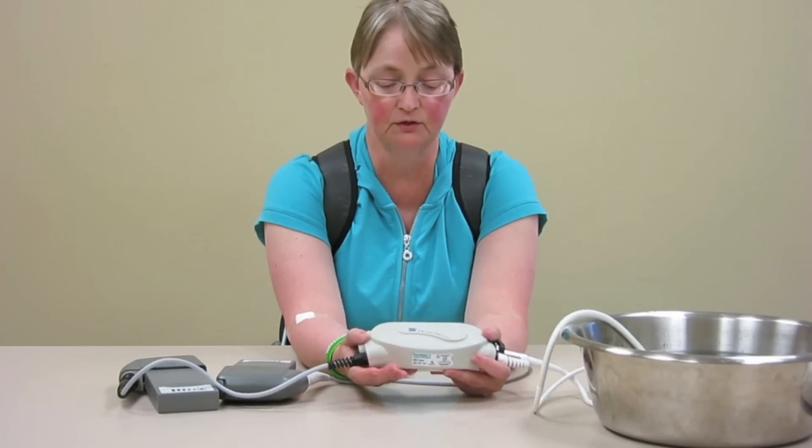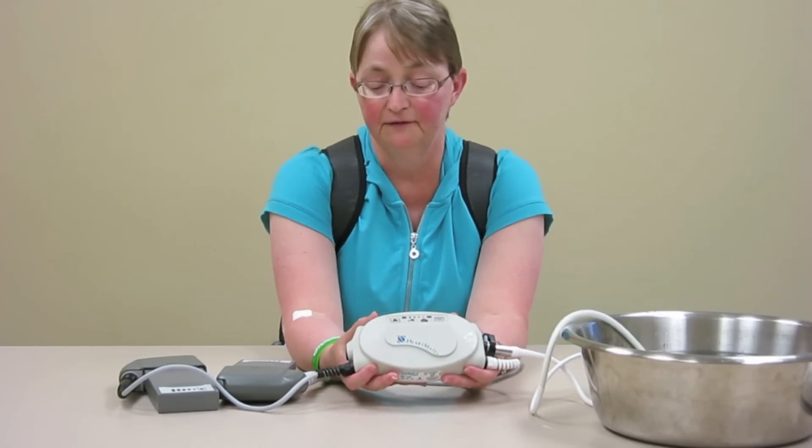And as you can see, there are also lights that will tell you if there's an issue.